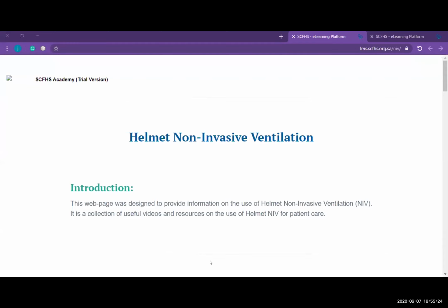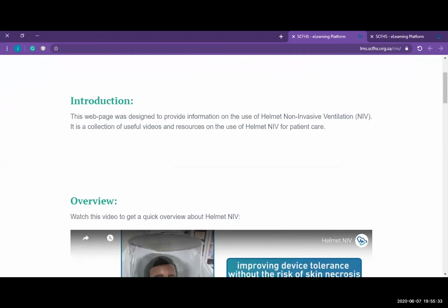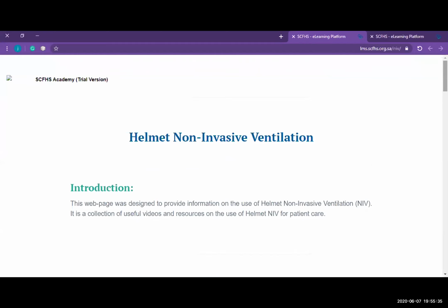Again, you have to watch your expiratory minute volume. You have to watch your tidal volume. Again, the tidal volume here is going to be very high, like 1,000 or more, because most of the volume is going to be lost in the helmet. I wouldn't really recommend using the Oxylog in this case with the helmet. We would like to make it clear: use a classic ICU ventilator when you're using the helmet.